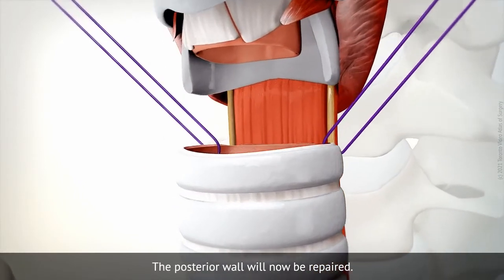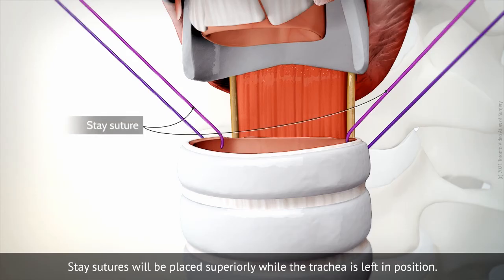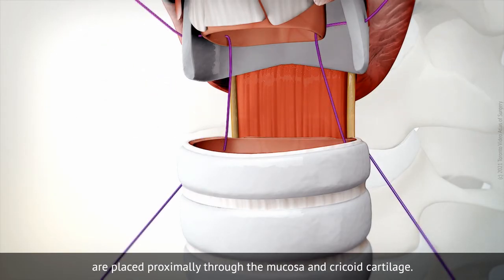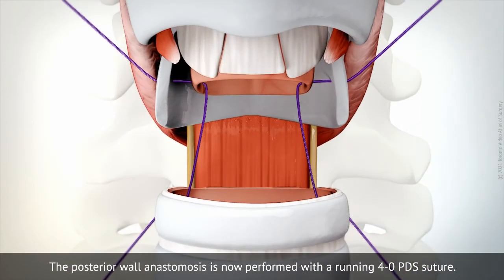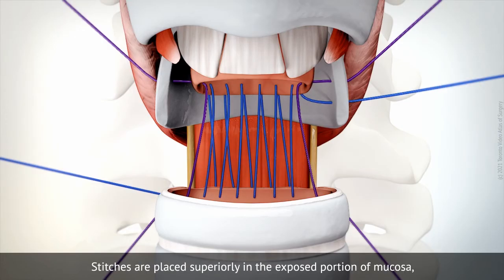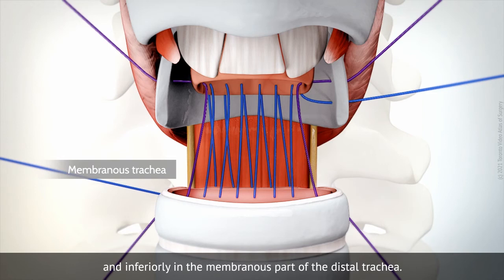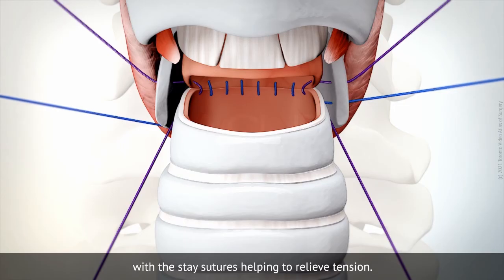The posterior wall will now be repaired. Stay sutures will be placed superiorly while the trachea is left in position. The stay sutures from the posterior distal trachea are placed proximally through the mucosa and cricoid cartilage. The posterior wall anastomosis is now performed with a running 4-0 PDS suture. Stitches are placed superiorly in the exposed portion of mucosa and inferiorly in the membranous part of the distal trachea. The posterior wall ends are brought together carefully, with the stay sutures helping to relieve tension.